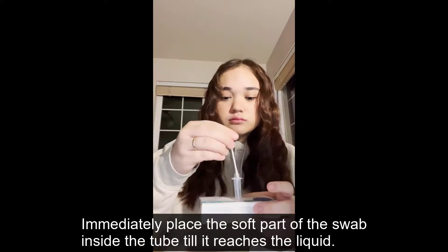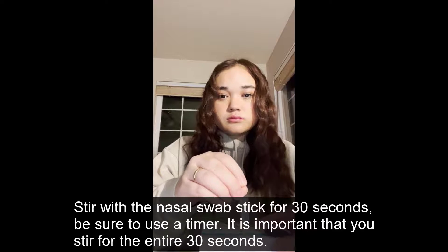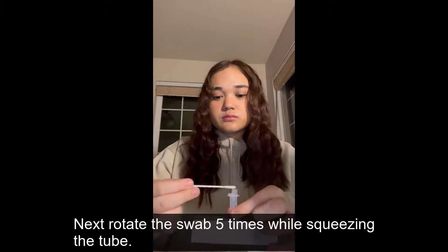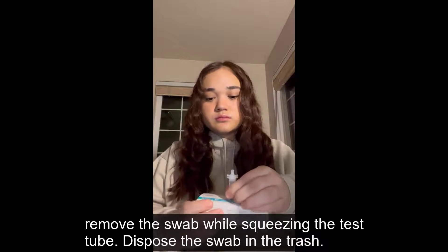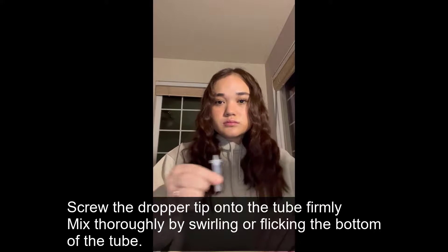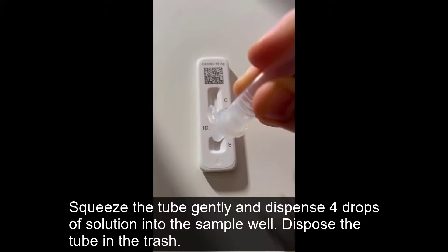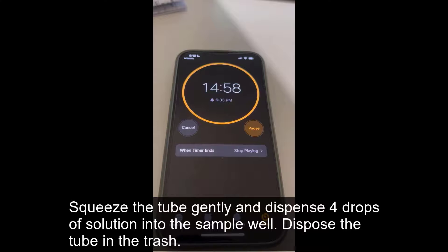Step 4: Testing. Immediately place the soft part of the swab inside the tube until it reaches the liquid. Stir with the nasal swab stick for 30 seconds — be sure to use a timer, as it is important that you stir for the entire 30 seconds. Next, rotate the swab 5 times while squeezing the tube. Remove the swab while squeezing the test tube and dispose of the swab in the trash. Screw the dropper tip onto the tube firmly. Mix thoroughly by swirling or flicking the bottom of the tube. Gently turn the tube with the dropper tip downwards and hold vertically. Squeeze the tube gently and dispense 4 drops of solution into the sample well. Dispose of the tube in the trash.